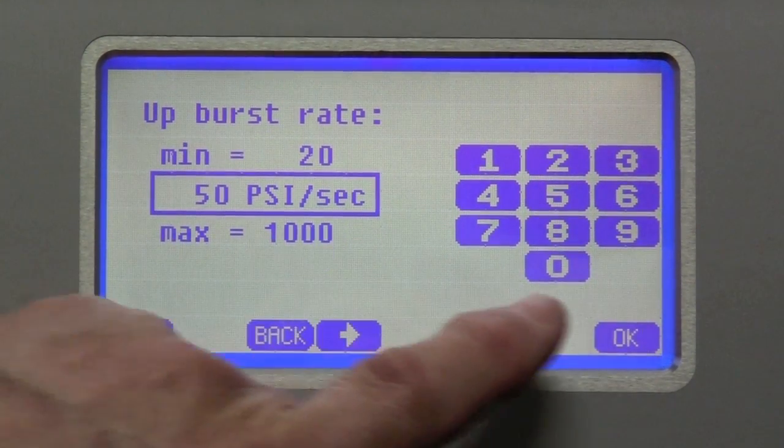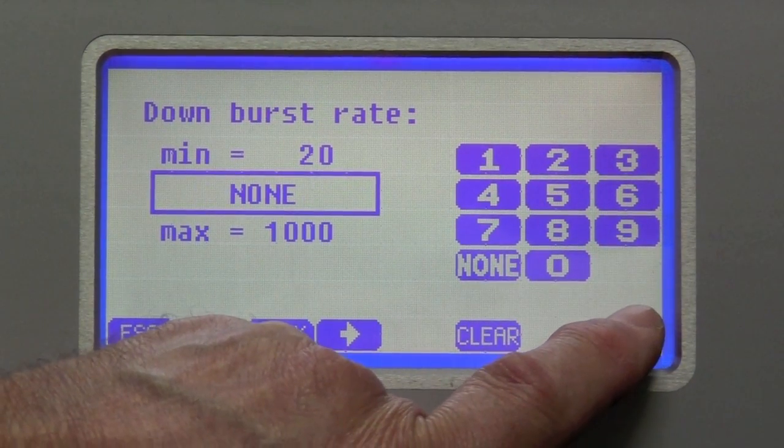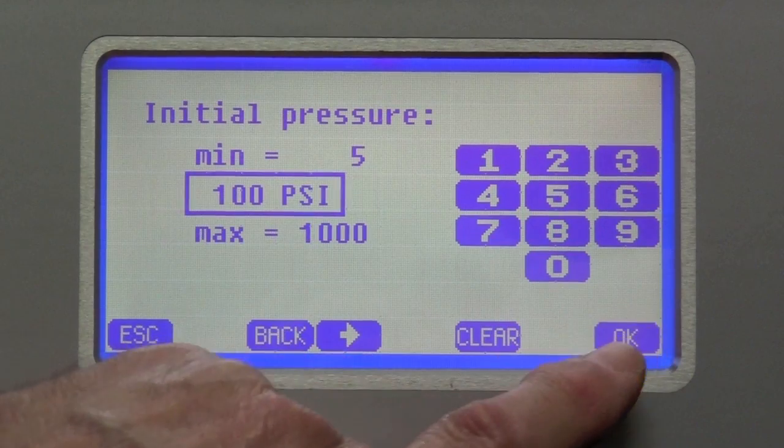The upburst rate defaults to 50. We're going to leave it there because we're not looking for a burst. We don't care. We are not looking for a downburst. So we leave that there.